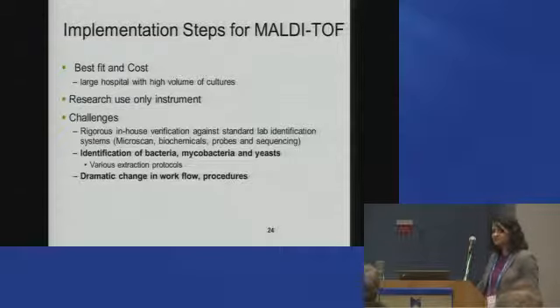So in terms of implementation of MALDI-TOF, like I said, a lot of labs are considering bringing this on, and several have already implemented MALDI-TOF. For us, it was really important to look at how well this would be implemented in our setting. Is it a good fit for us? Because we are a large hospital with high volumes of culture, so we said, yes, this is absolutely going to be worth our while to work on this.